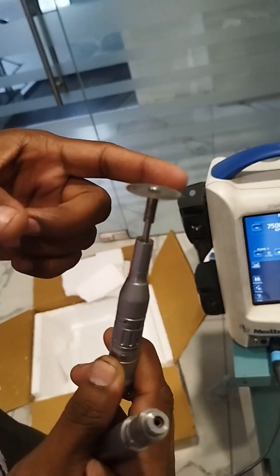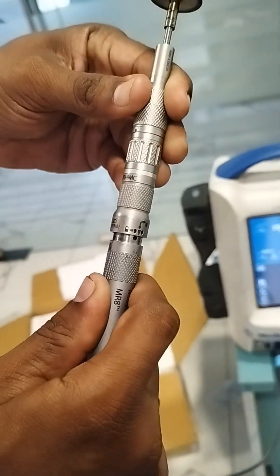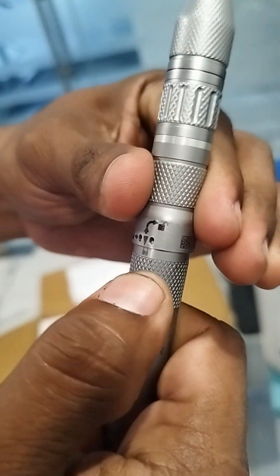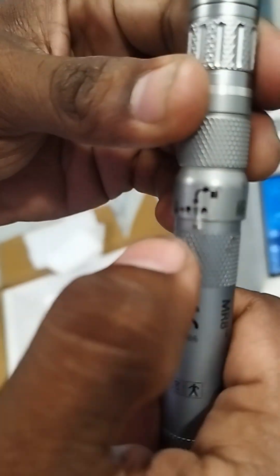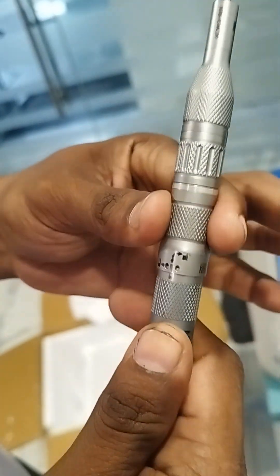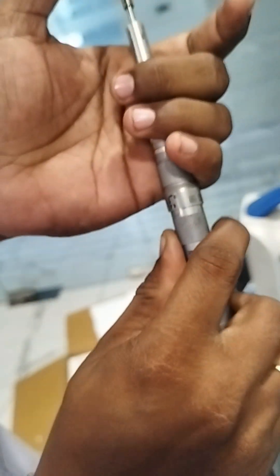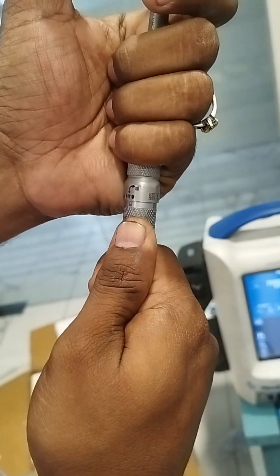Then you can connect this to the motor. Press the motor and the same way go from unlock to lock. You can see the unlock-to-lock symbol here. While removing, hold the attachment and take it out — you can see the arrow mark indicating that. While locking, simply put it inside and lock.